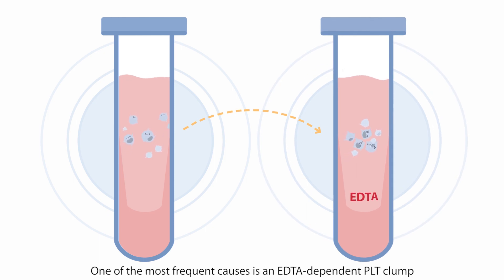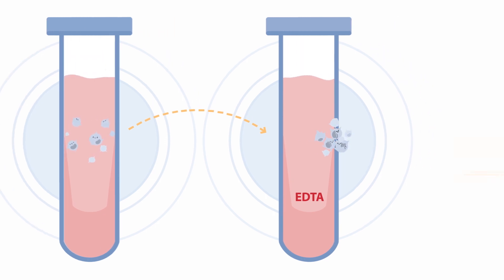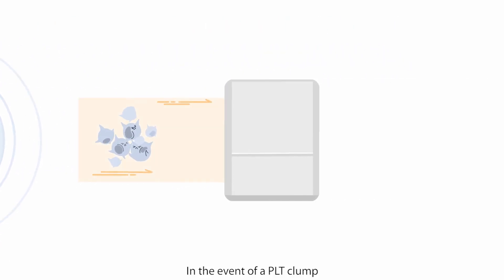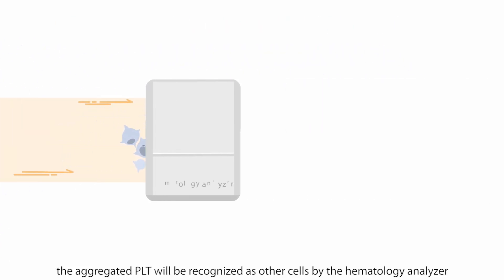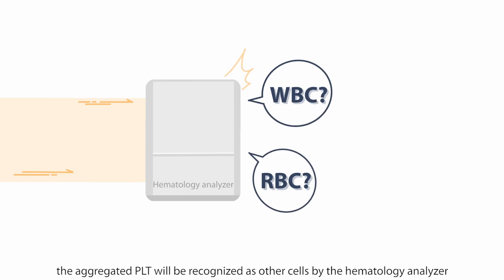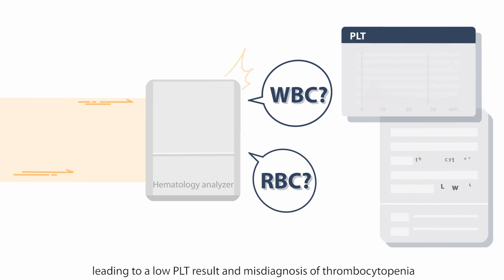One of the most frequent causes is an EDTA-dependent PLT clump. In the event of a PLT clump, the aggregated PLT will be recognized as other cells by the hematology analyzer, leading to a low PLT result and misdiagnosis of thrombocytopenia.